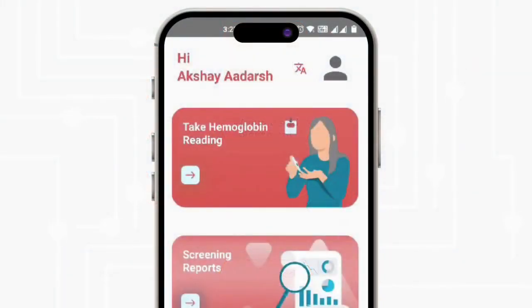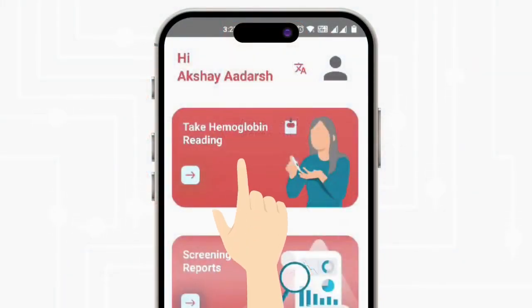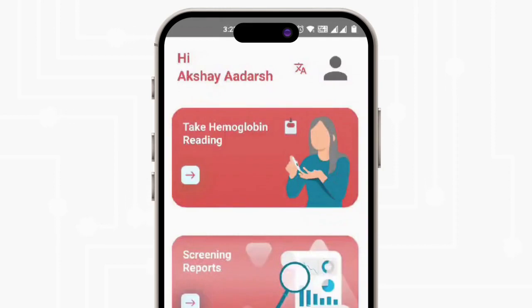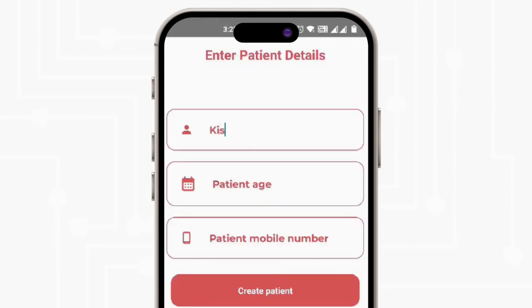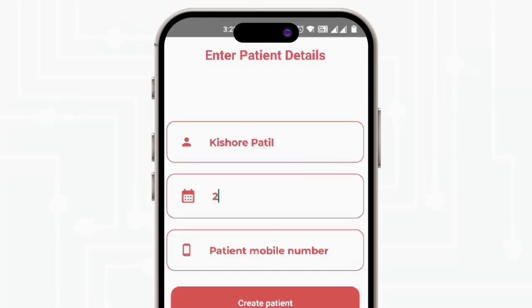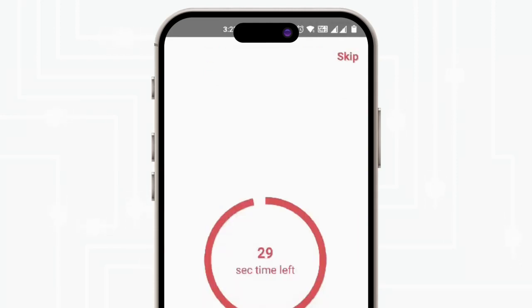Click on Take Hemoglobin Reading. Enter patient details including name, age, and phone number. Wait for 30 seconds for the blood to react with the test strip.